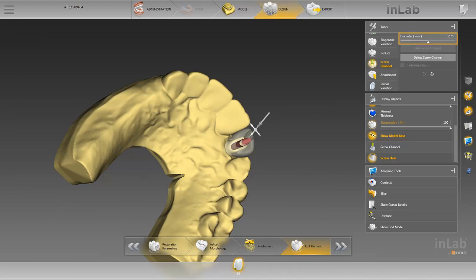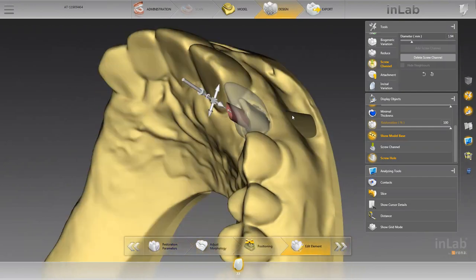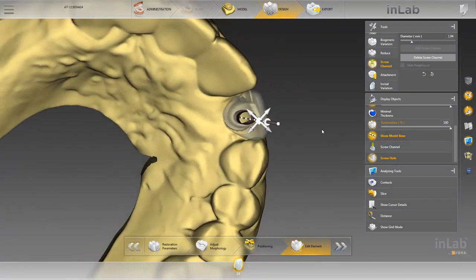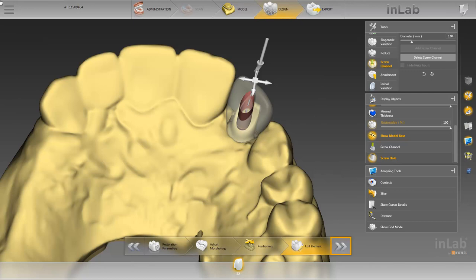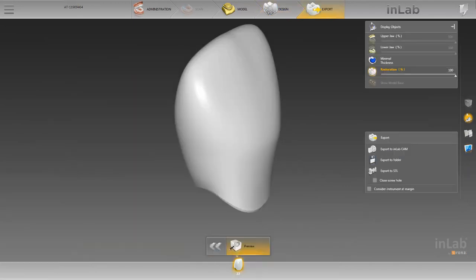Additionally, the diameter of the screw channel can be optimally modified by moving the slide control. Next, you see the 3D model with already adjusted position and diameter of the screw channel. Clicking the double arrow moves us to the export phase. At this point, we take another look at our restoration from different angles and could start the production of the restoration thereafter.